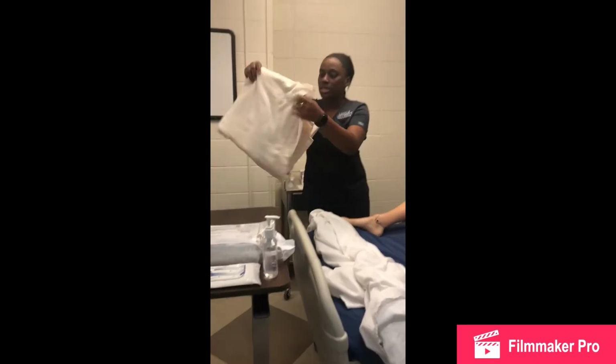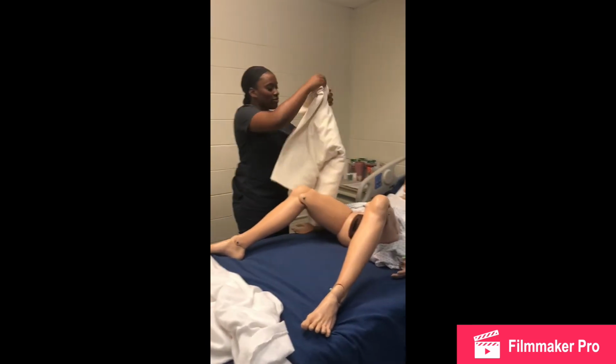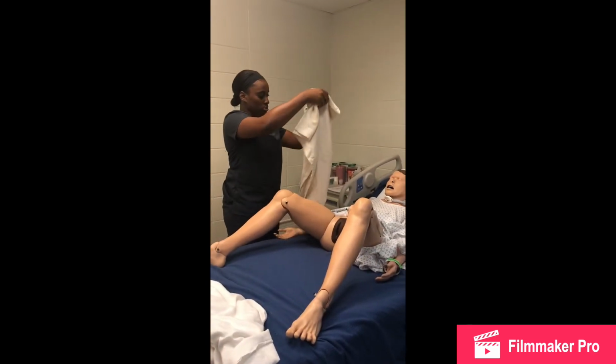I'll use a bath blanket to give my patient more privacy, to let them feel like they're not too exposed.